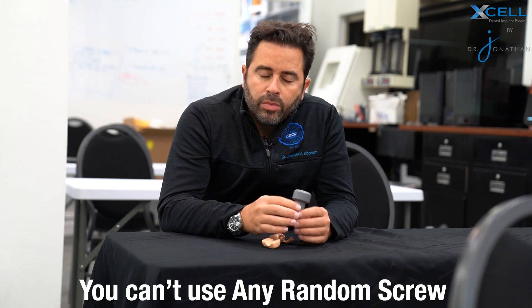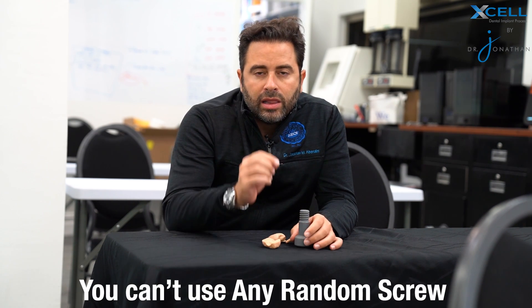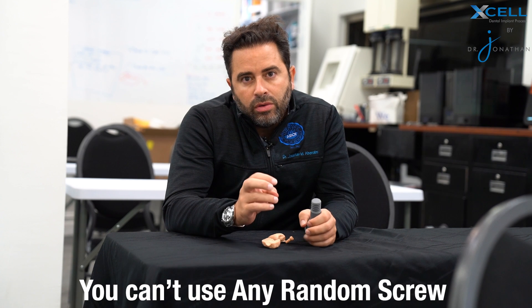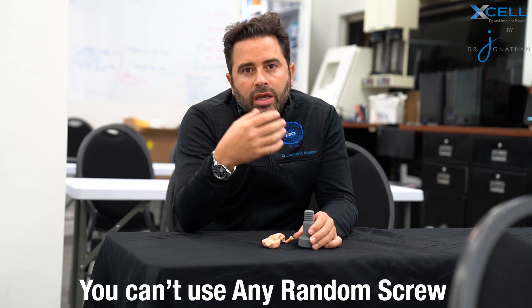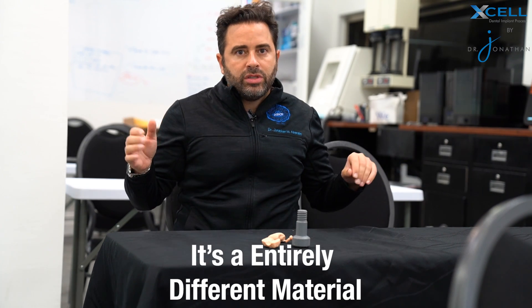A lot of companies out there say, hey, use our screw. The problem is you cannot just take a screw, lengthen the thread, and allow a screw that's designed for titanium to be used in zirconia or PMMA. It's just a completely different material.